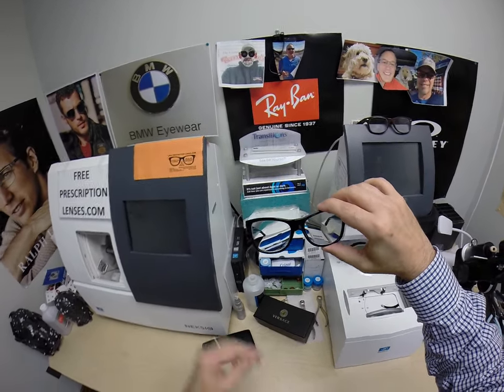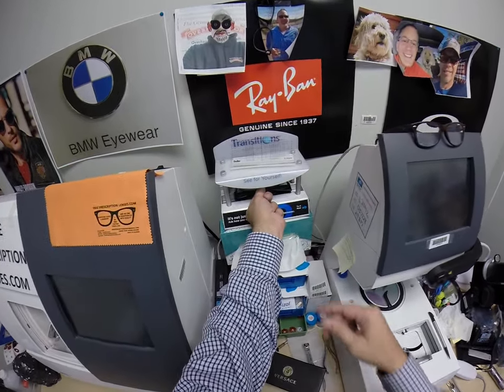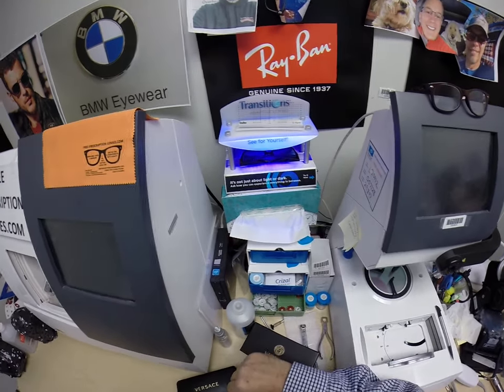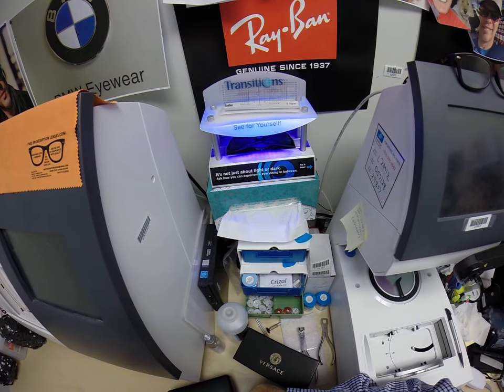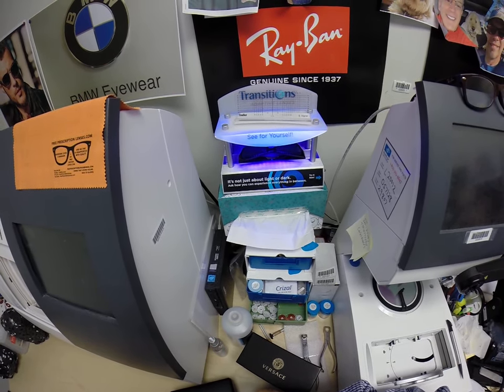Let me show you what these look like dark. I'm going to expose them to a strong burst of ultraviolet light. Now as you can see, it takes about 30 to 45 seconds for them to turn dark. It takes a little bit longer when you come back inside — 45 seconds to a minute, to a minute 15.